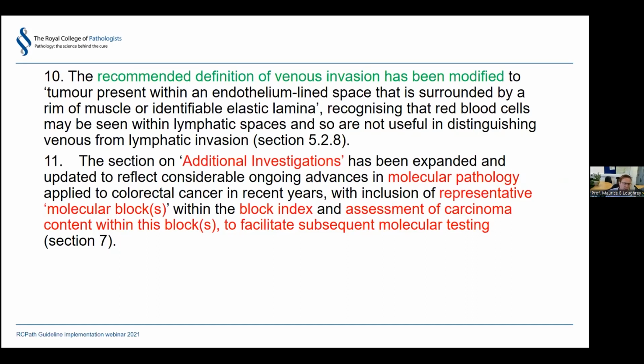So based on the total cellularity of the block, what's the percentage of neoplastic nuclei, or carcinoma nuclei to be more specific? This doesn't have to be very precise, but what we're really looking for is encouragement to identify the block with the highest such percentage, because this is very useful information for the genomic hubs or genomic labs that we deal with. If you have greater than 50%, for example, carcinoma cellularity, that means that they don't have to do macrodissection for most of the assays that they're chasing.